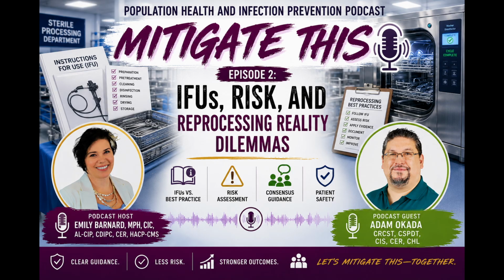More of what we see is vague IFUs or things that are difficult to quantify. So in sterile processing, we always use the example of copious amounts of water. What amount is a copious amount of water? We have no idea what that is, but that's what it'll say: rinse with copious amounts of water. And so those kinds of things are, again, just a frustration. We do our best to follow them. And of course, in sterile processing, we have to follow our IFUs, but it's not always easy and clear.